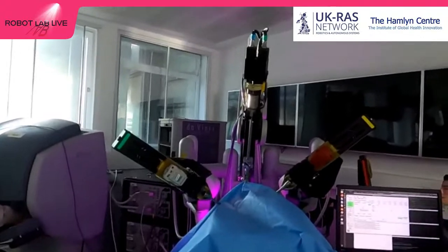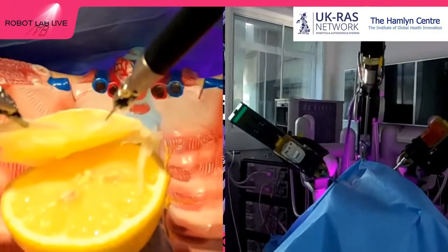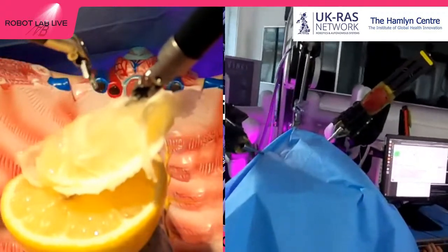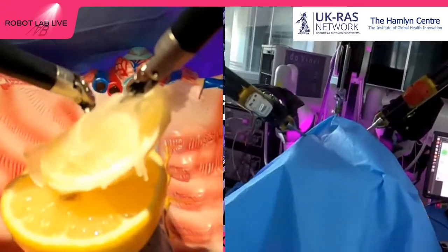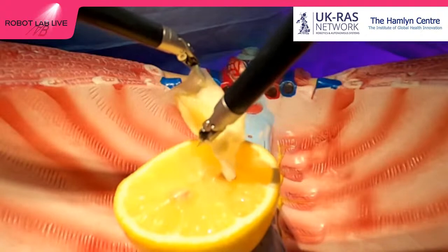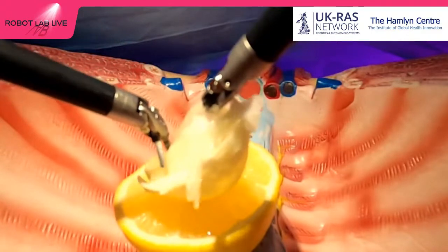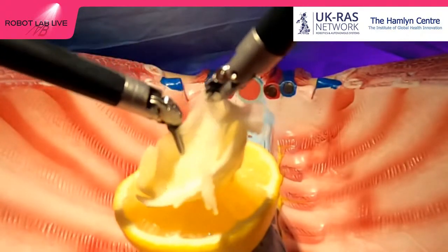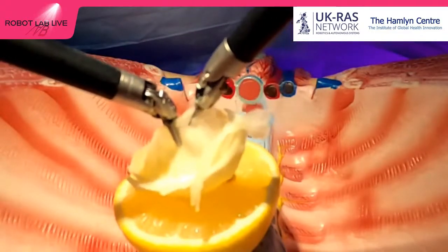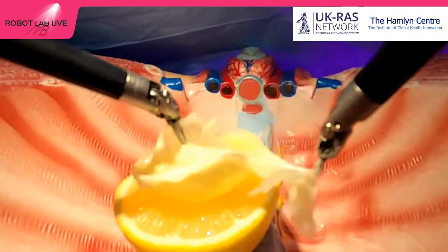But when it comes to a real surgical procedure, things are not. Sorry. But if we want to think about the future and an autonomous procedure in the future, we have to teach the robot to think the same way that the surgeon is thinking or is making decisions, right? So you may see it, right? And the lemon is something that is static, right? It doesn't have any movement.